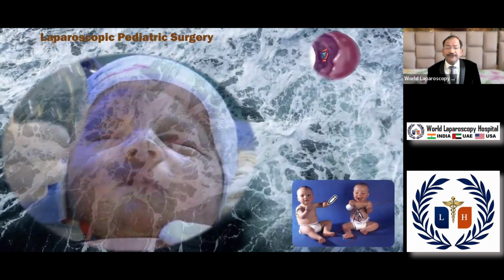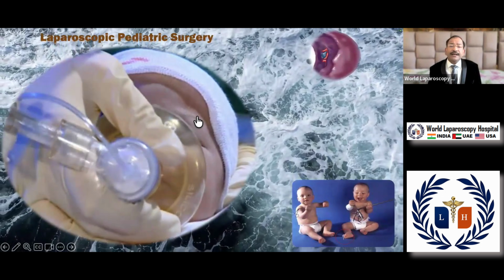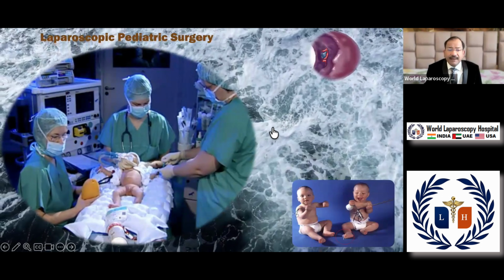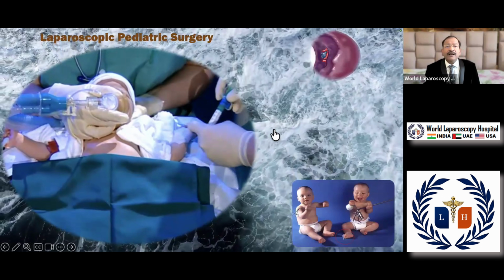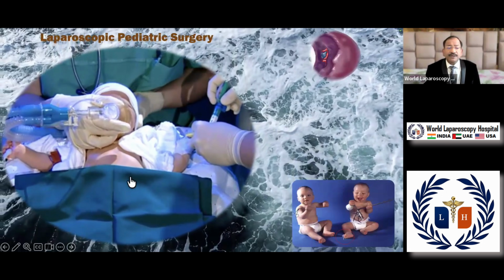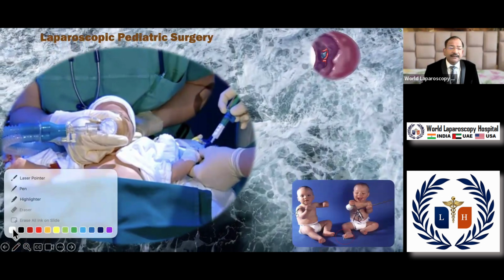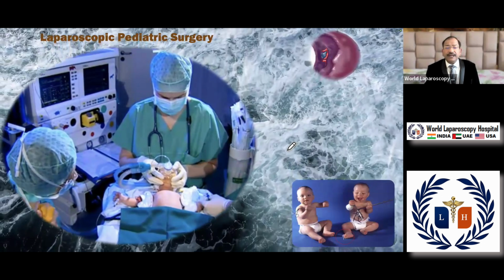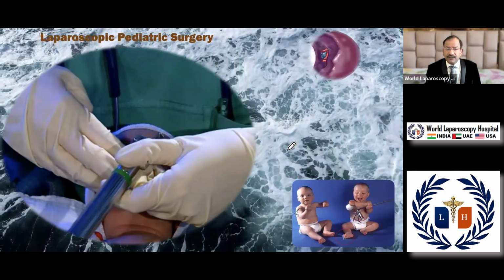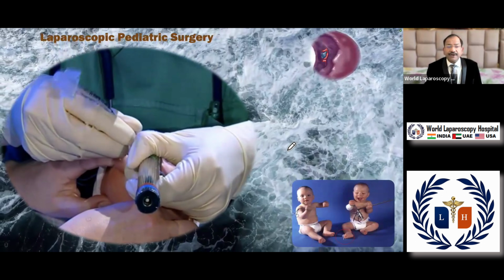Now coming to pediatric surgery. Albert Einstein has said that there are no great discoveries or advances as long as there are unhappy children in the world. And in almost all pediatric procedures today, laparoscopy is the method of choice. The only thing you must keep in mind is that access should be very careful. You have to use an uncuffed endotracheal tube, otherwise there will be vocal cord paralysis. So, this is an uncuffed endotracheal tube.